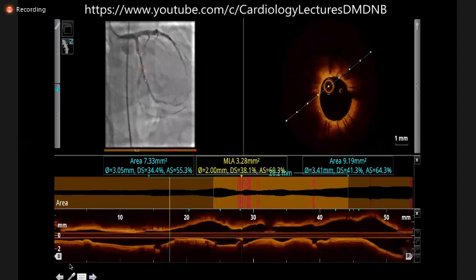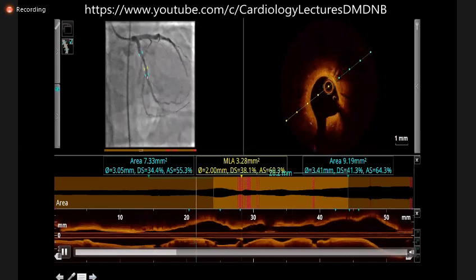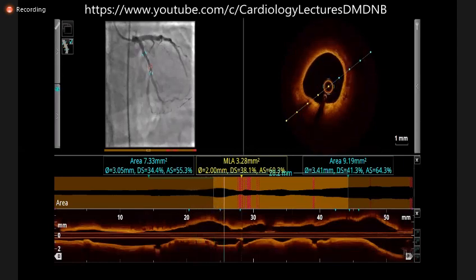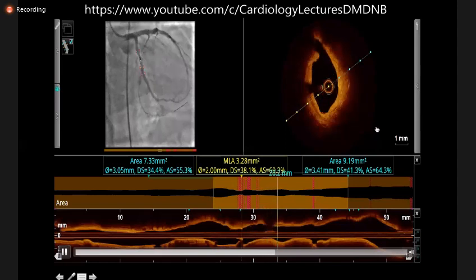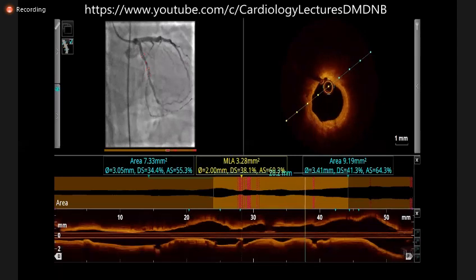It's a previous stent which has been well deployed and well endothelized. It's about 7 years back. Now we are entering the lesion. The cutting balloon has done a good job, and you can see a lot of fibrosis which has been there all along. And good cuts have been made.